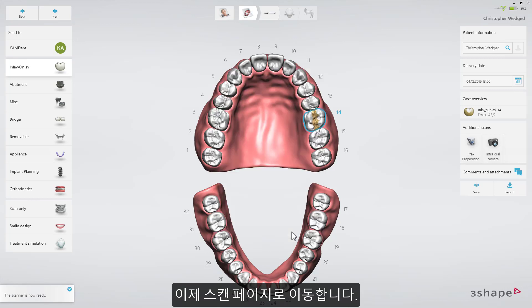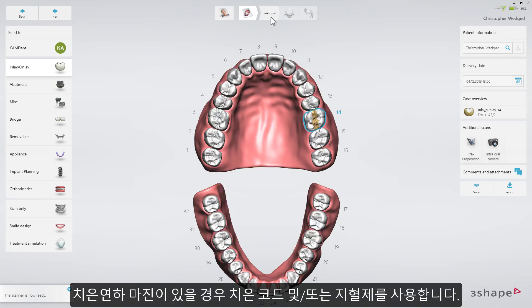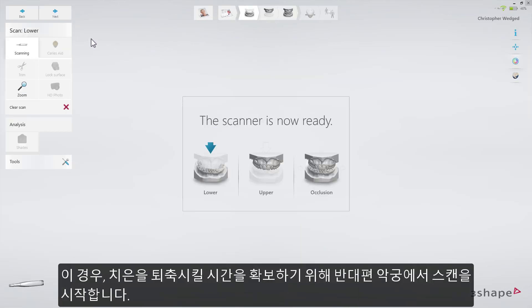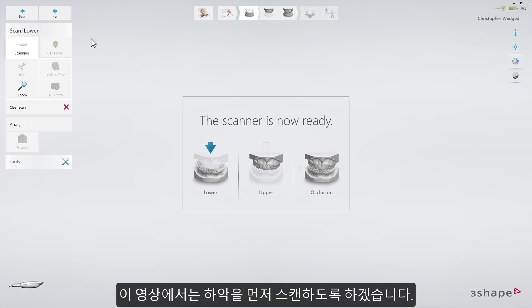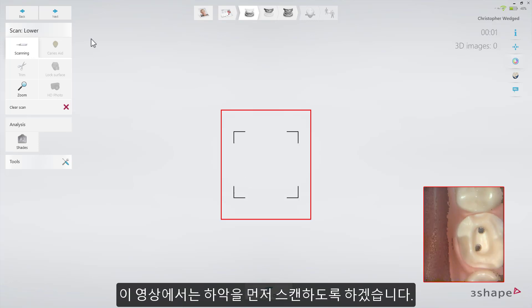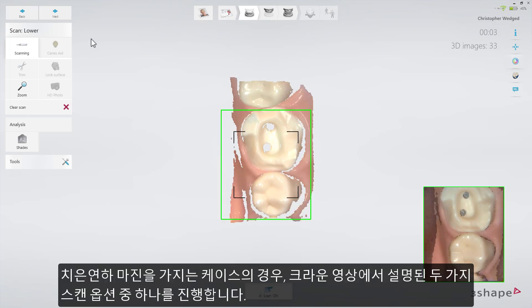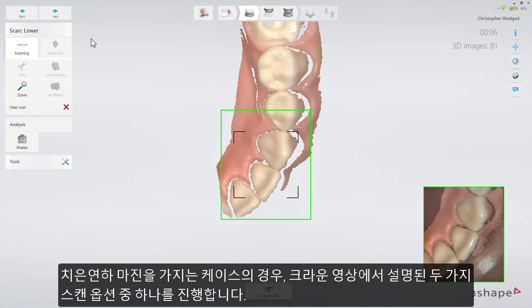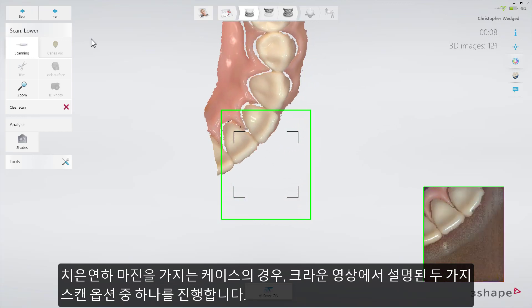Now proceed to the scan page. Use a retraction cord and/or a hemostatic agent if parts of the margin line are subgingival. In this case, start by scanning the opposing arch to allow time for the retraction methods to take effect — we'll start by scanning the lower arch. For cases where parts of the margin are subgingival, follow one of the two scanning options outlined in the crayon video.